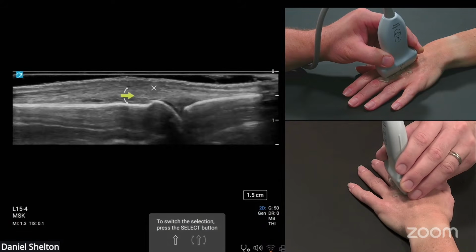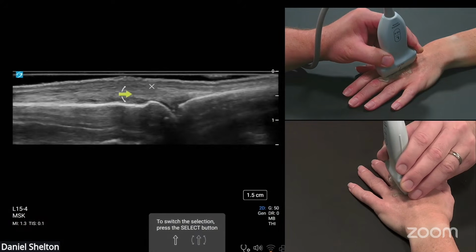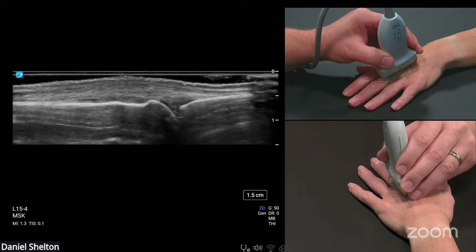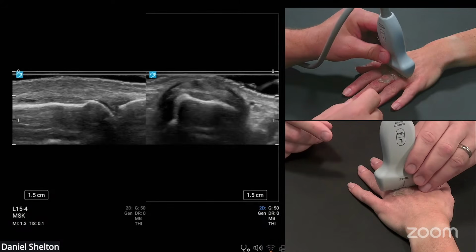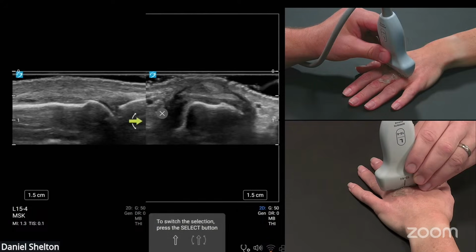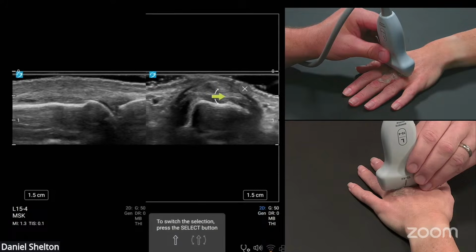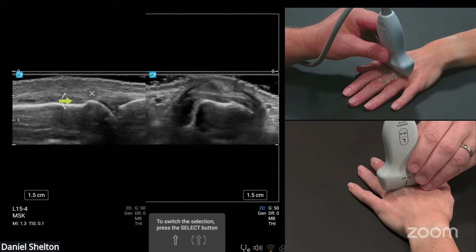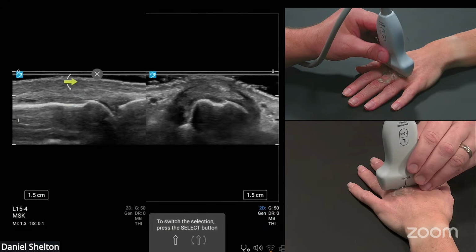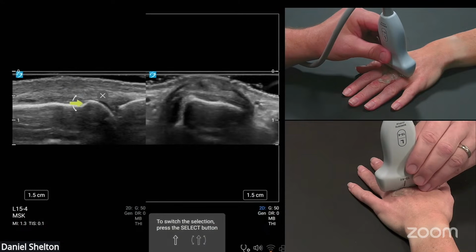in the other plane. Remember, we went and saw a deep sagittal band, but the deep sagittal band was in long axis this way, split the screen. So I'm going to use the dual feature, and then I'm just going to rotate the probe. Left side will be radial there. And we can see that long axis, deep sagittal band underneath the extensor tendon. So extensor tendon, long axis, deep sagittal band, and metacarpal notch. And you can see that reflected over here. So here we have a long axis extensor tendon, short axis, deep sagittal band, and then the metacarpal notch. So we're at the same level. So screen right is taking about this slice here, because I can see the metacarpal notch right here.